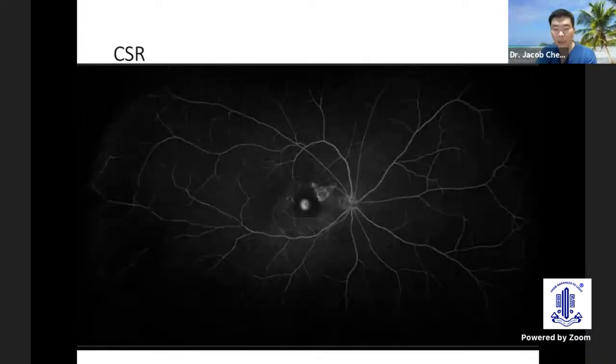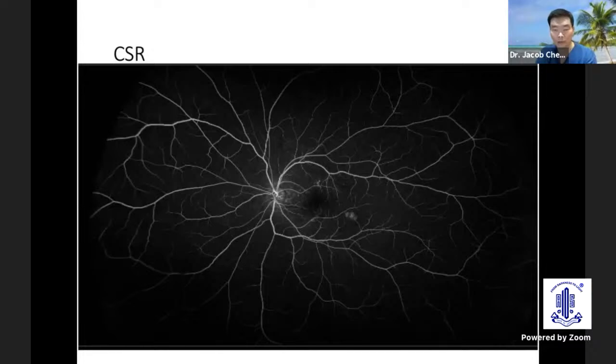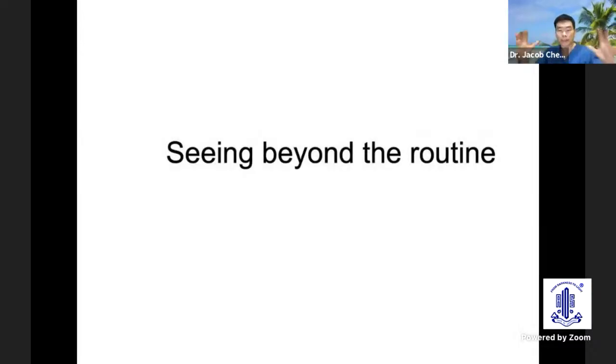This can be confirmed on a widefield fluorescein angiogram, which I'll talk about after this. You can see the ink blot kind of leakage on the right eye. And again, routinely one would screen the left eye, where this patient has a double pathology. So these are some of the routine cases.